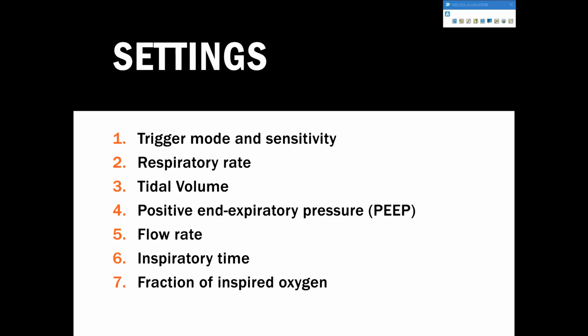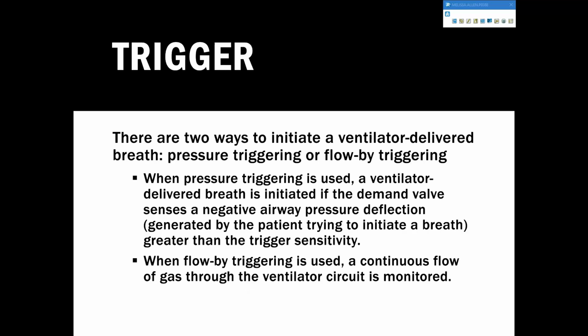Okay, so the things we want to talk about are all of our settings. Some settings are definitely ordered, and that's what the doctor wants. But other things I feel like we don't pay enough attention to and we don't always use to the best of our ability. Trigger and sensitivity is one of those, as can be flow rate. So let's go into trigger.